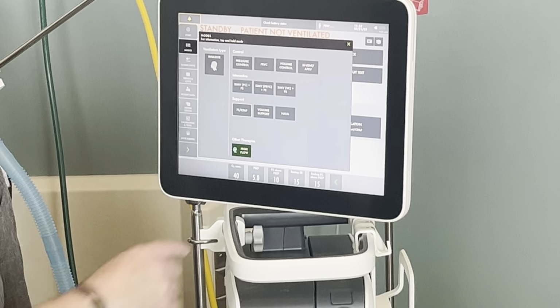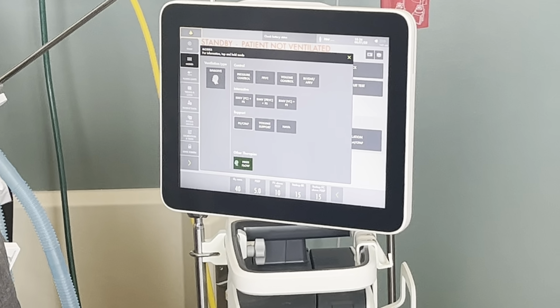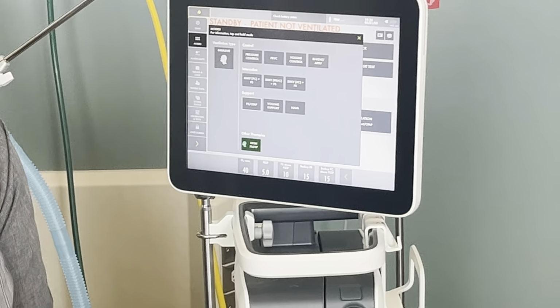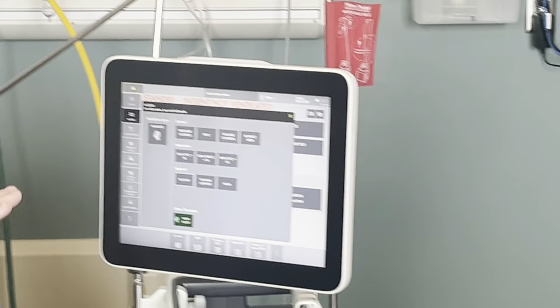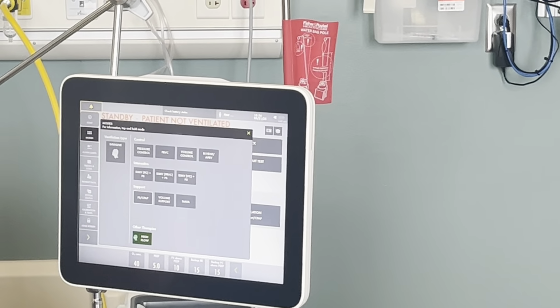So basically, in pressure control, these three modes, if I set the rate to 15, can you breathe over that? Absolutely, yeah. But it's not spontaneous. If you trigger a breath after that, it's still gonna go to my preset settings, and it's gonna do the preset time, the preset I-time, the preset everything, right? It's just gonna lag. You trigger it, this is what you get. It's up to me, not up to you.